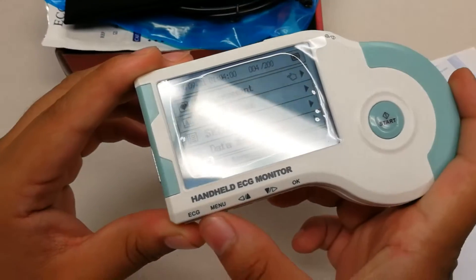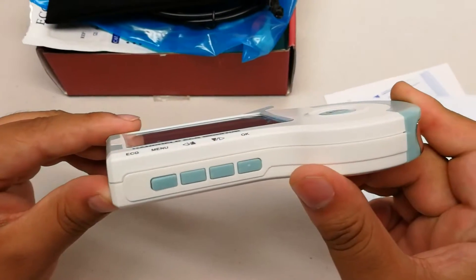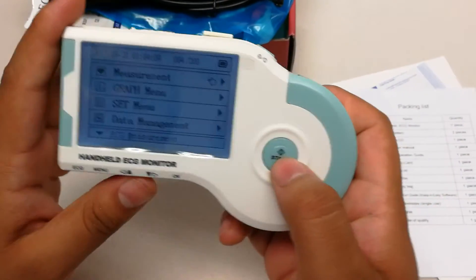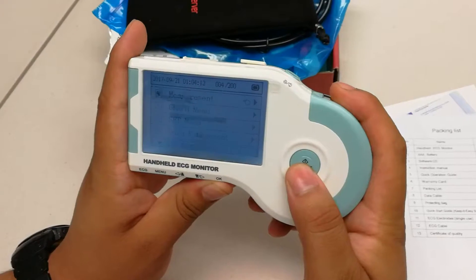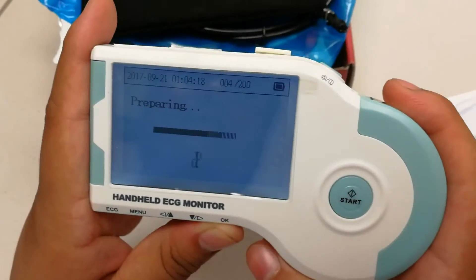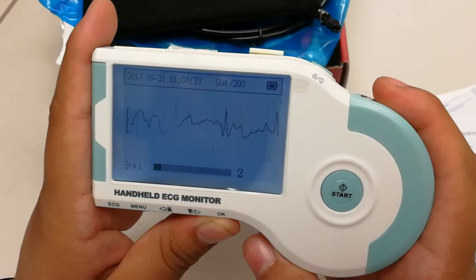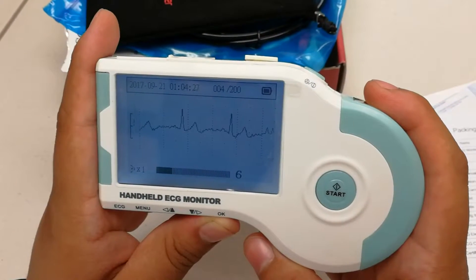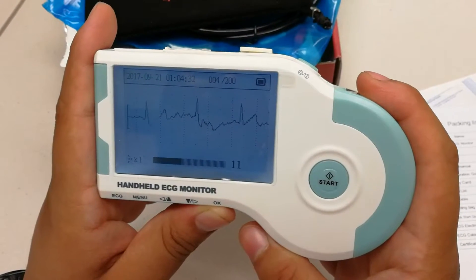As you can see here, there are directional buttons on the bottom side of the item. You can press start and make sure to place your fingers as such, and it should begin to give you a reading. This reading should be about 30 seconds.